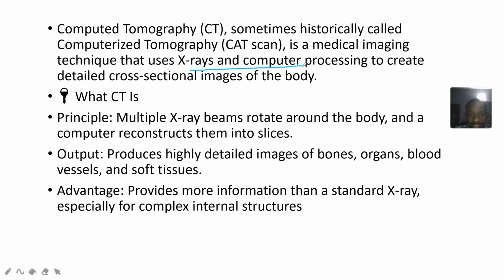So the principle is a lot of X-rays rotate around the body. A computer will then reconstruct all those pictures into slices. As output, you have good images of the bones, of the organs, of the blood vessels, and soft tissues.